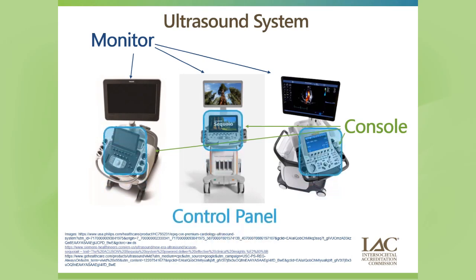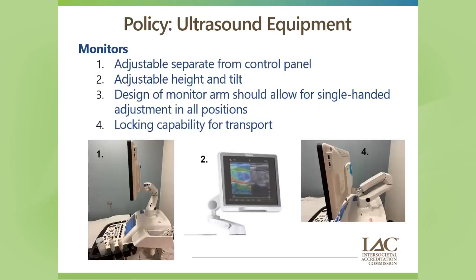And then the other part that goes along with the console is the control panel. Is it user-friendly? Are the buttons close enough? What is my reach factor as far as what I'm going to do with my exam, and trying to minimize some of that. So those are just some small parts of the large ultrasound system to break it down into.